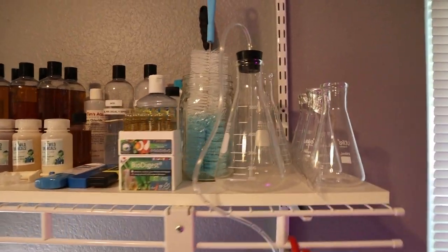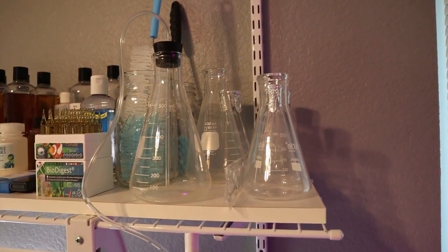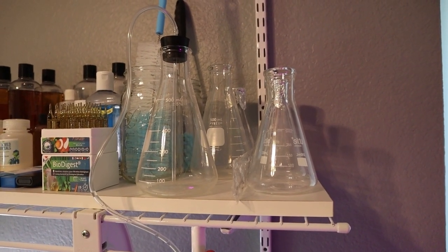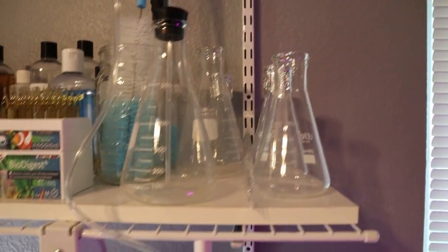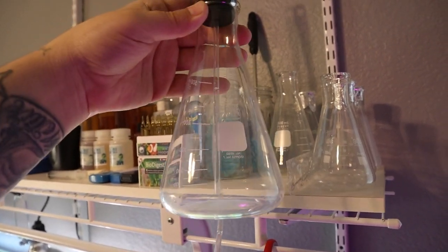For my culturing containers I like to use glass, simply because I can sterilize them easier. You can also use HDPE plastic such as the type found at a homebrew store, and you can also use the disposable poly bags like the ones used in phytoplankton by Poseidon Reef Systems, but I just like to use these little Erlenmeyer flasks. They're easy to sterilize and pretty easy to work with.